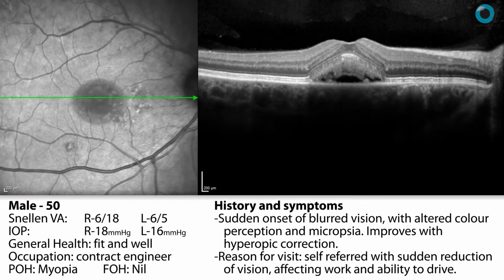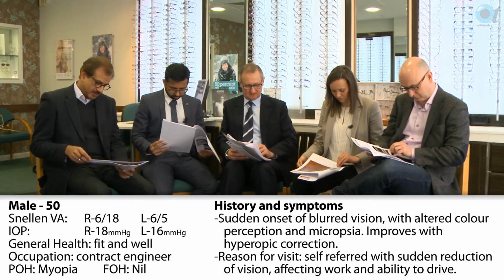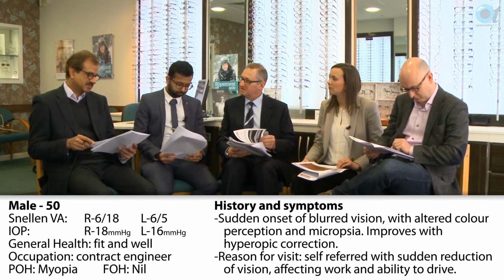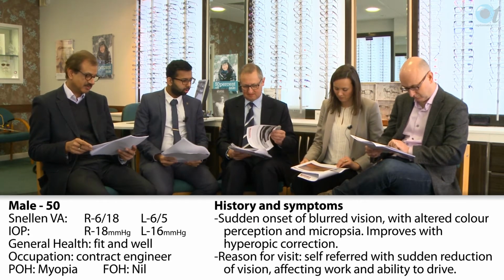But then looking at the OCT image, it's not particularly, to me. No, but the OCT image doesn't necessarily show all of those areas. Sure. What about the bit just a bit below? I wonder if there are some drusen on the side there as well, which would be consistent with age, possibly smoking, but we don't know that.